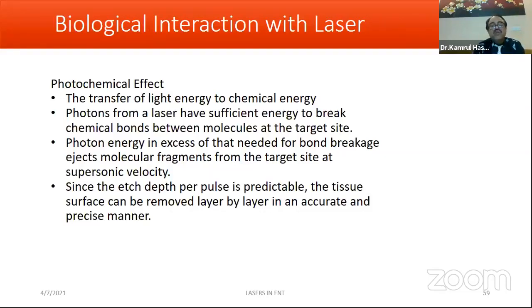It is absorbed in the chromophore and the retina. But during surgery, you should think of the patient, the eyes should be closed, but there is a chance of corneal injury, laser injury in that case.